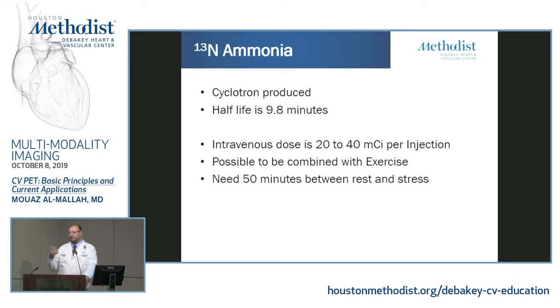So it is technically not that favorable for high volume labs. If you have too many patients, you might keep putting patients, every 10 minutes, you have to put a patient on the table, move, put, move, put, move. And you have to have enough rooms where the radiopharmaceutical is decaying. While with rubidium, by the time you're done with your image acquisition, all the radioactivity has decayed. So it is better for labs that are doing high volume.